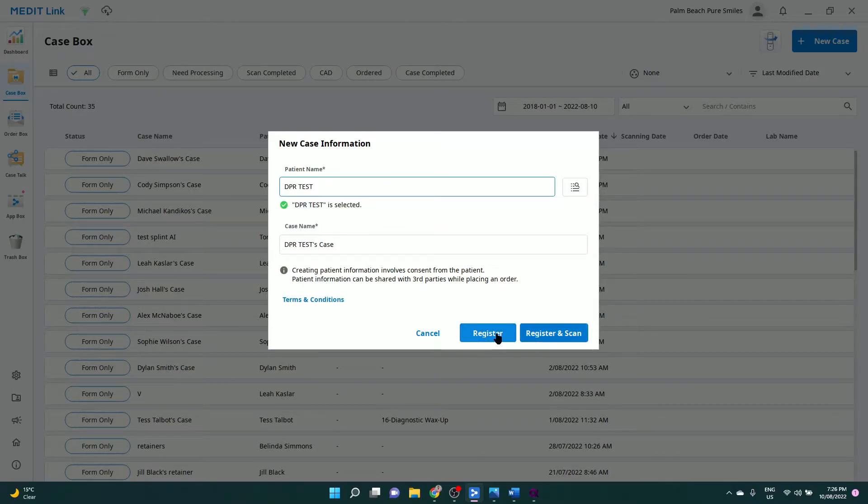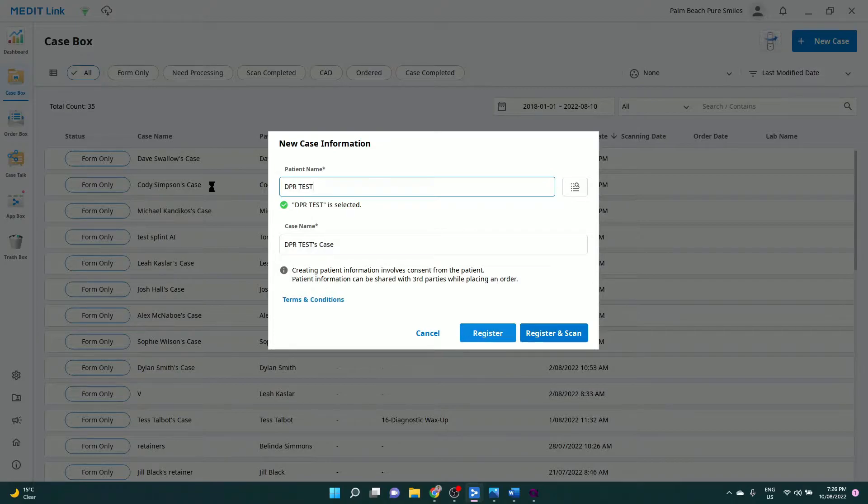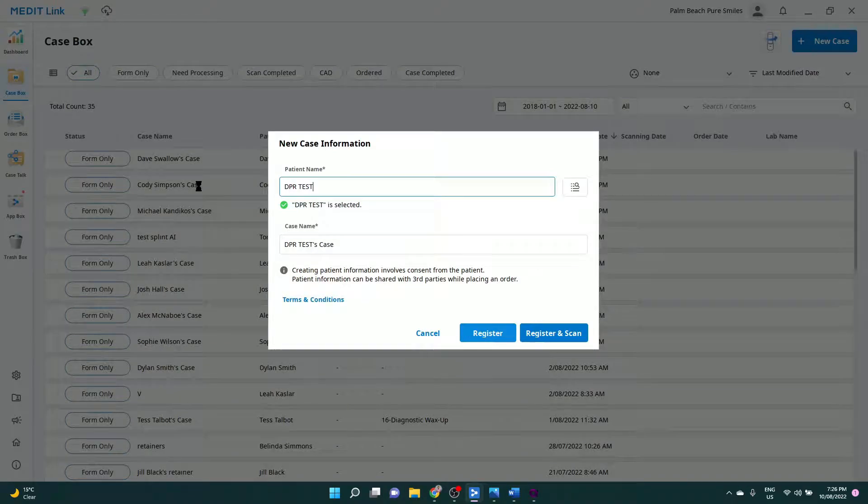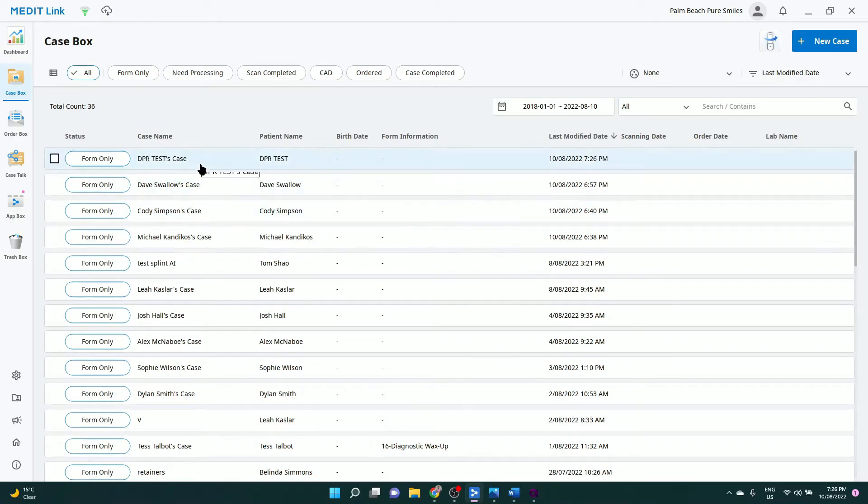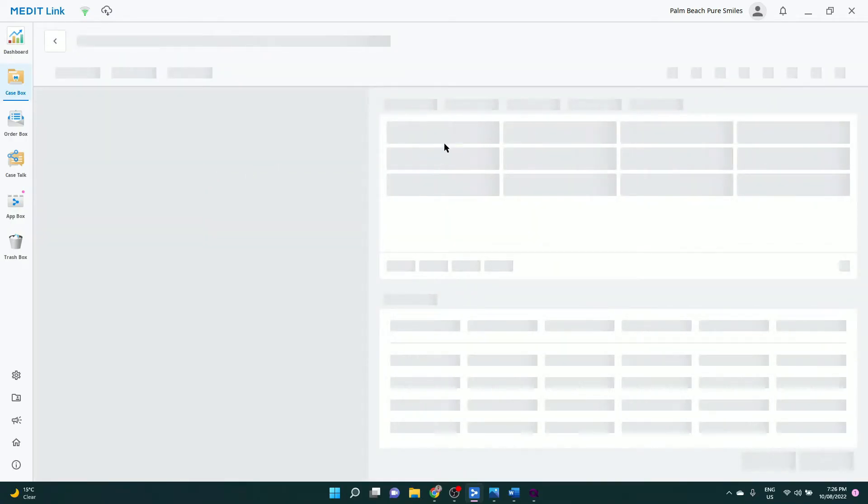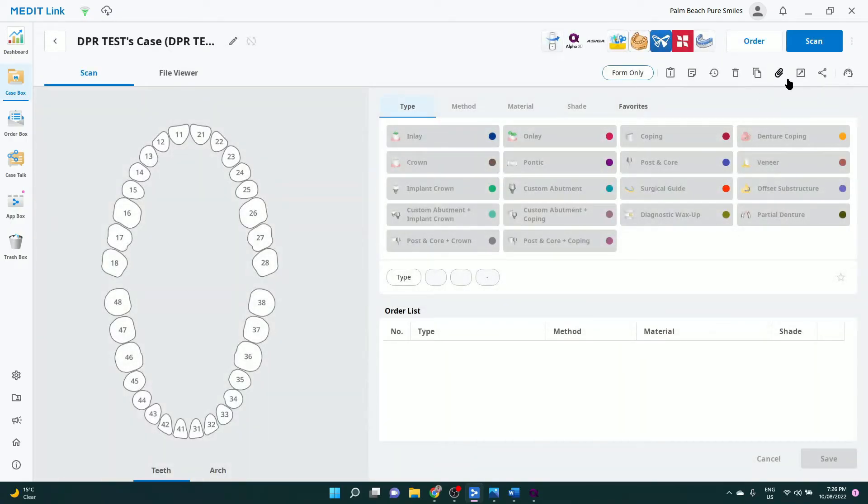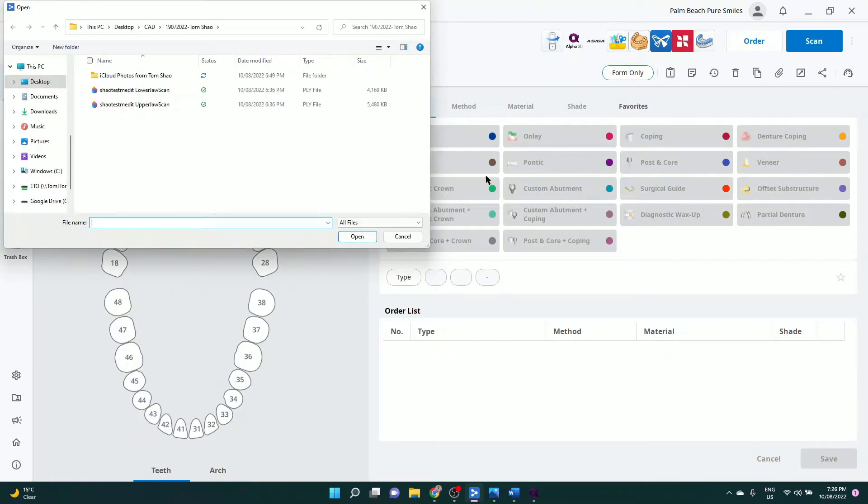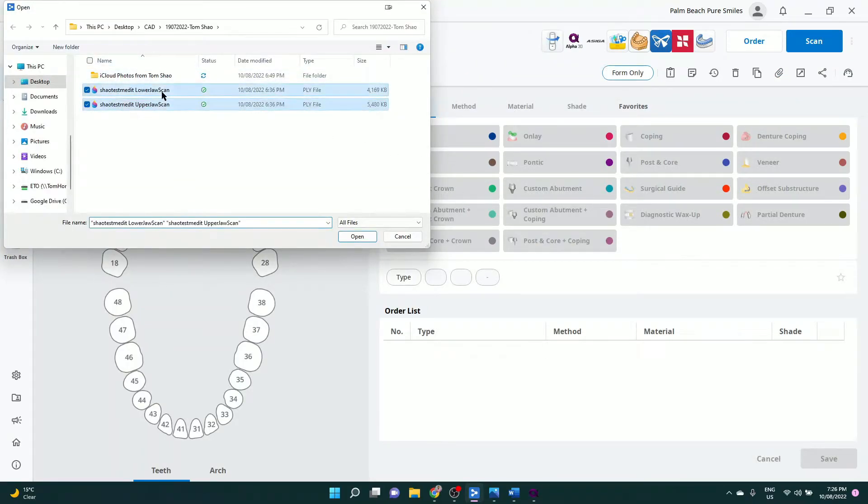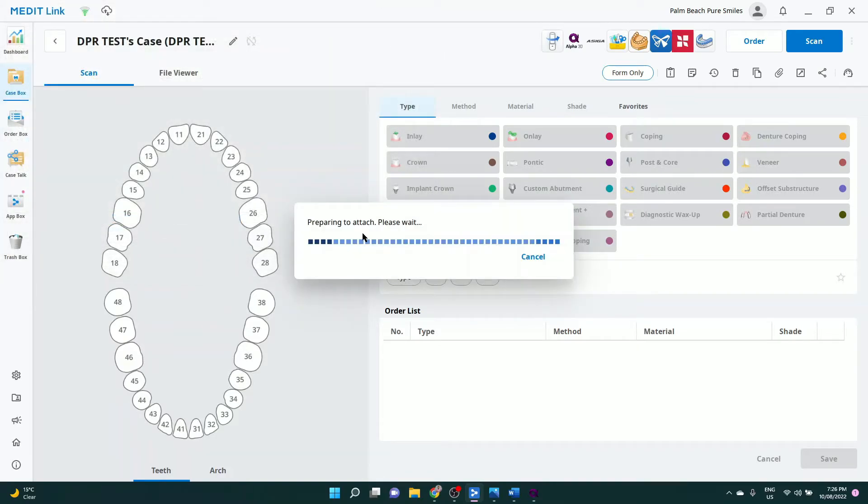We will register only and not scan. We will import locally exported files. In this case, it came from my Trios in a PLY format. You attach to the case.